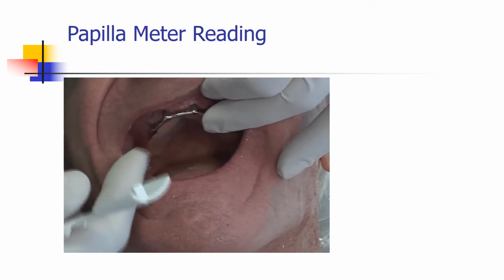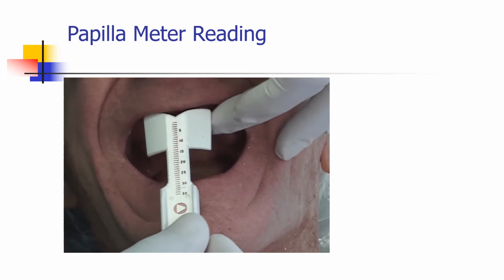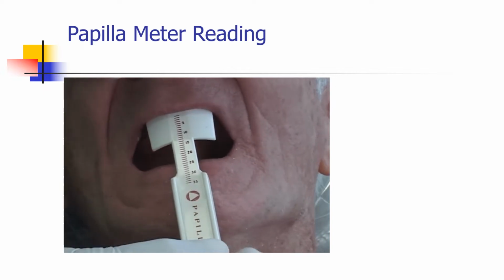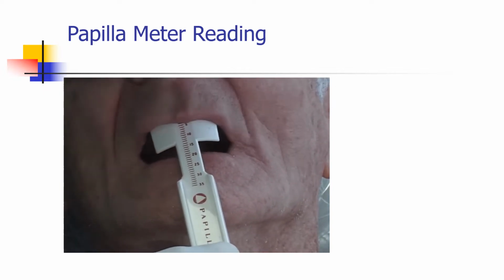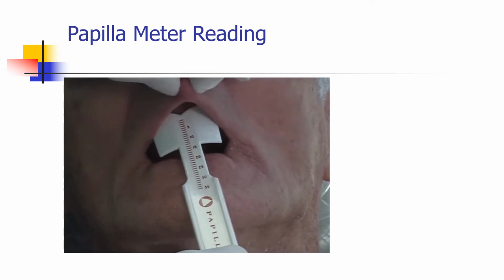We put the bar back in, the little stop here fits right onto the bar. If you're doing dentures, that fits onto the ridge. Just relax your jaw and just relax your lip. We just pull the lip up, just deadpan drop it onto that. Don't pull it, just let it drop.